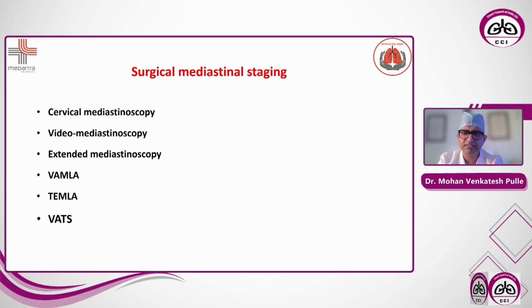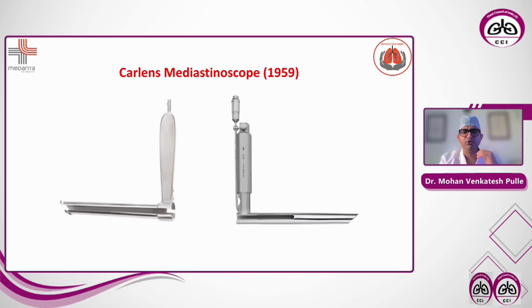There are several modalities which we name as cervical mediastinoscopy, video mediastinoscopy, extended mediastinoscopy, VAMLA, TEMLA, and then VATS. There are various methods by which mediastinal lymph nodes can be sampled or mediastinal pathologies can be dealt with, which are in the armamentarium of the surgeon. So let's start with the mediastinoscope.